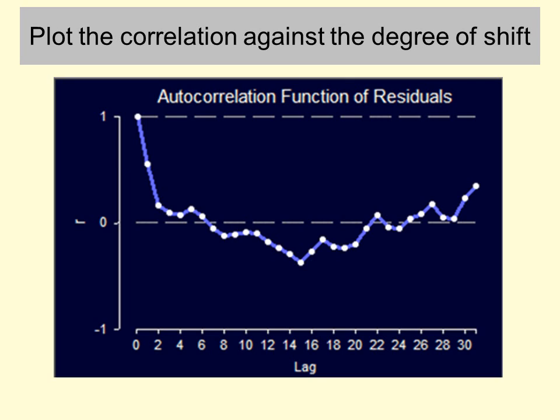We also see some correlations at much longer lags here which are negative, and I suspect that that's because in this time series the high pass filter has not been applied. If the high pass filter has been applied, you shouldn't really see those, I think. What we're most concerned with is those correlations at lag 1 and 2.